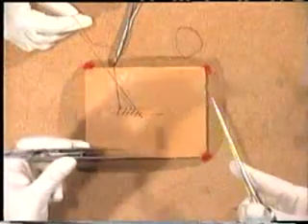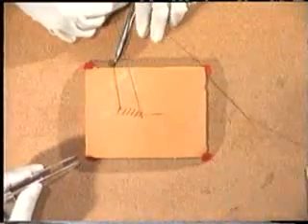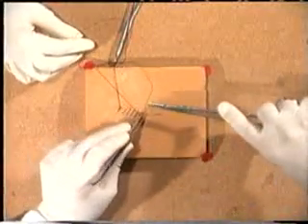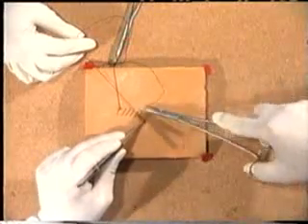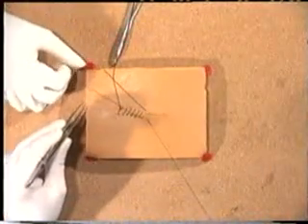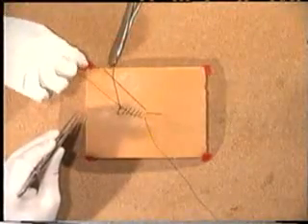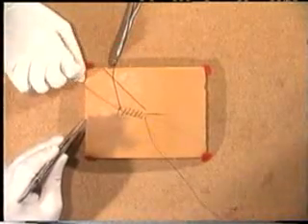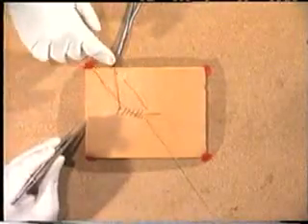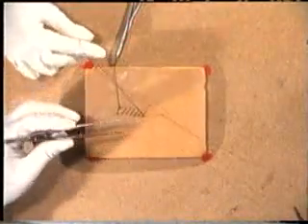As one continues along the incision, it is important that the suture material does not get caught around instruments, as you see here, and your assistant should remain alert to such a danger. Unfortunately, in this case, the assistant was not alert and allowed the suture material to twist around an instrument. It now becomes increasingly difficult to untwist this, and panic sets in. The assistant then starts to put their hand into the middle of the surgeon's view, which is even worse, but eventually the suture material is freed. Pass it again to your assistant, who will be wary for the rest of the operation.